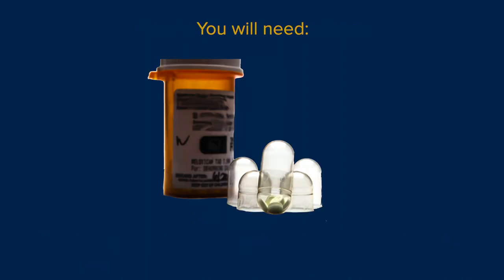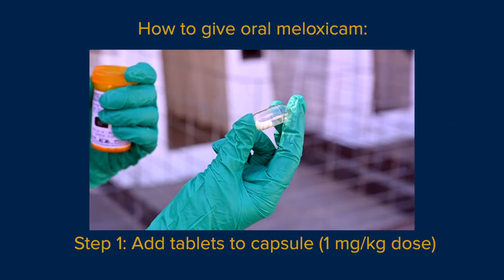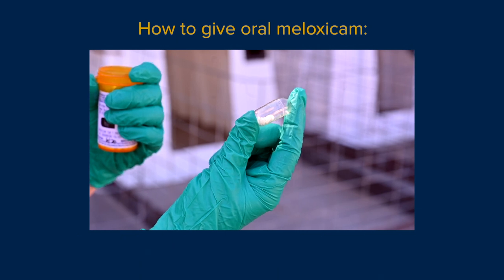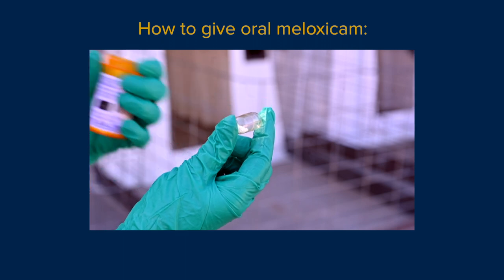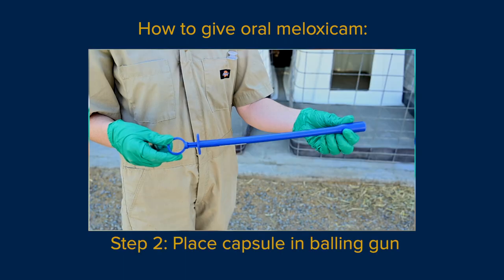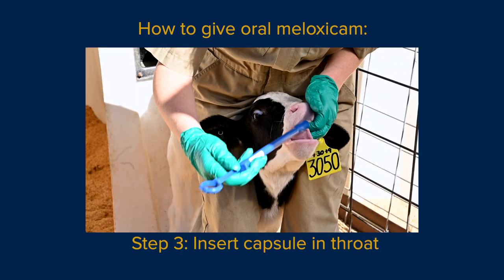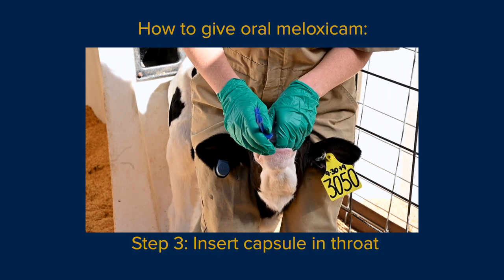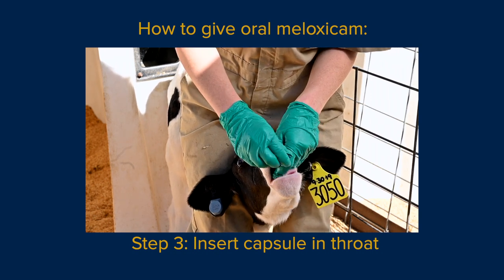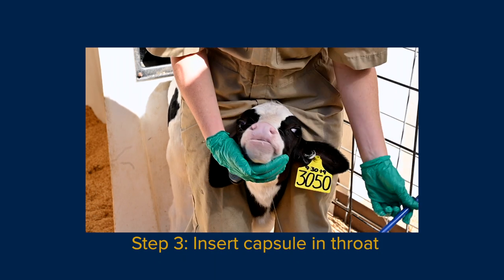To give oral meloxicam, you will need a prescription for meloxicam from your veterinarian, a gelatin capsule, and a balling gun. Calculate the number of tablets you will need for a 1 milligram per kilogram dose and add the tablets to the gelatin capsule. Extend the plunger and place the capsule in the balling gun. Straddle the calf and use your fingers to guide the balling gun down the center of the calf's throat. Push the plunger to release the capsule, then slowly remove the balling gun and check to make sure the capsule is swallowed.